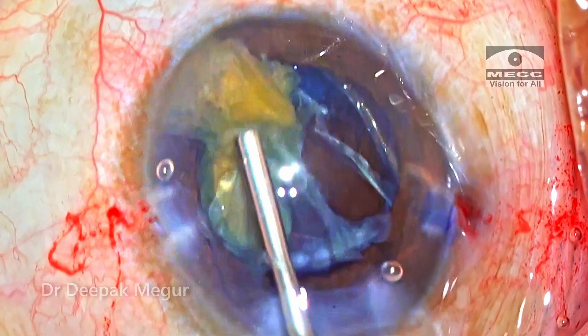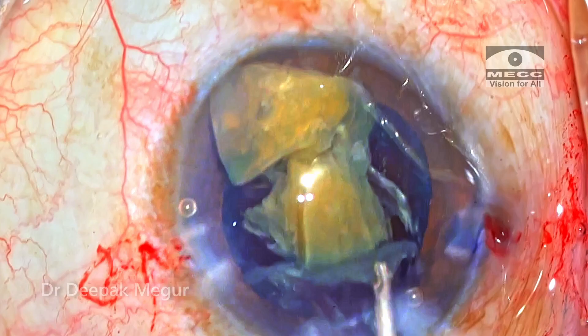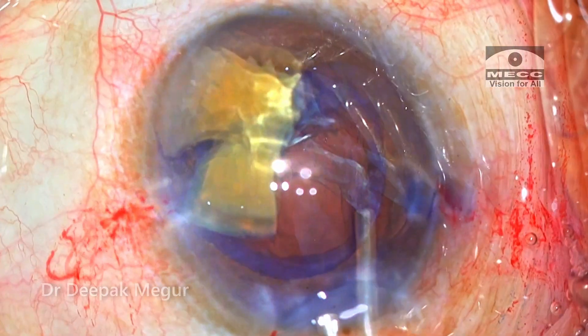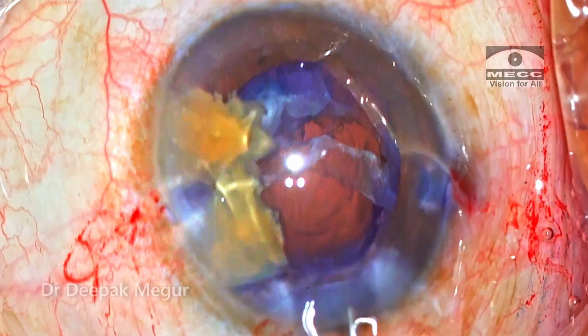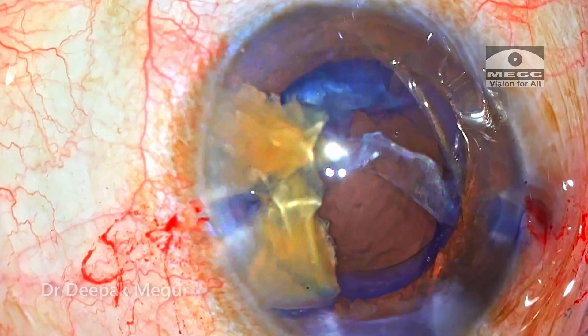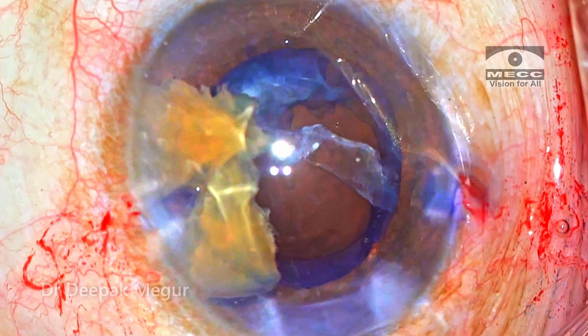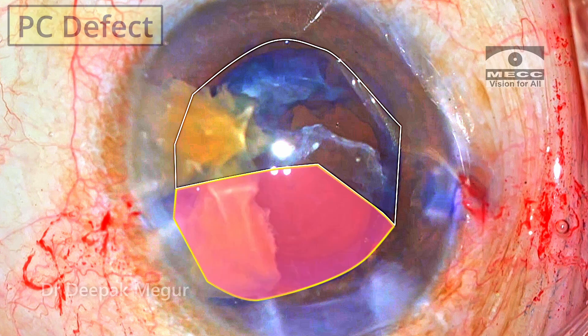The second fragment has actually descended quite far down. The cannula is helpful in lifting the two fragments, and I'm placing them above the iris and nudging them to the side so that I can see well enough. Now is the time to really understand where the tear is and how big it is — and it's going to be a challenge because there is an overlying sheet of epinucleus as well. I'm getting a faint idea that probably the distal half of the posterior capsule is still intact, and this empty-looking area is devoid of the posterior capsule. I'm expecting a large posterior capsule defect in the proximal half.